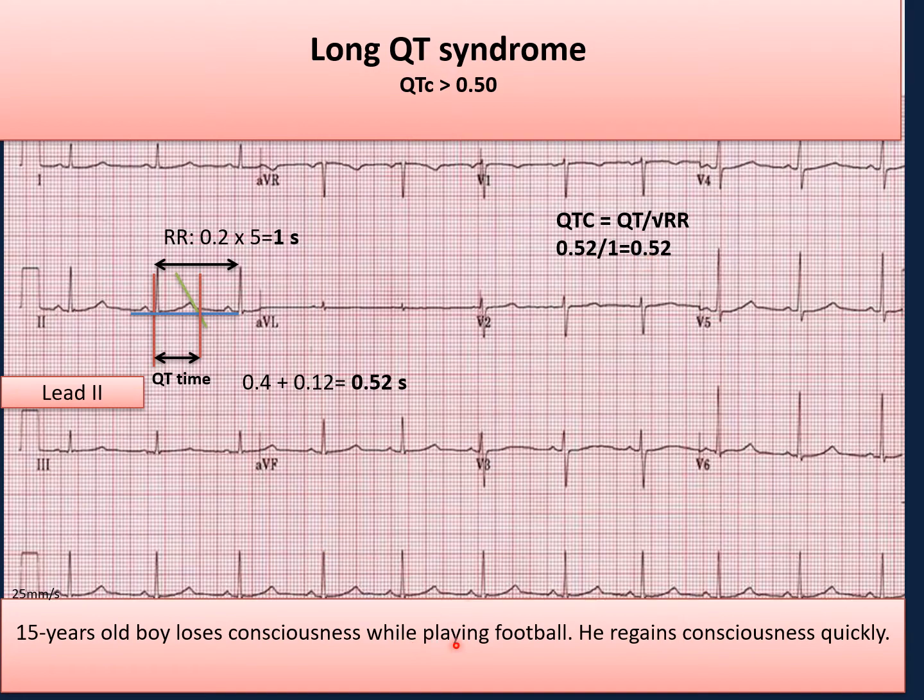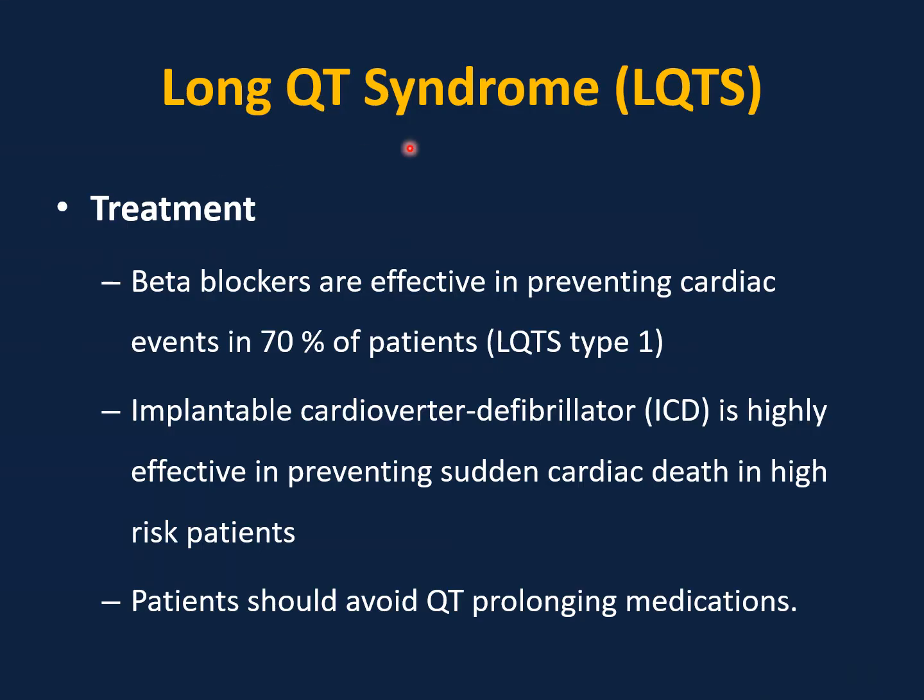That's why this adolescent is losing consciousness: because of the long QT syndrome. This can be precipitated by fear, startling, swimming, or exercise, because of the increase of adrenaline, and this will prolong the QT and can precipitate ventricular tachyarrhythmia and possible sudden death. Early detection, early referral, and treatment of cases of long QT syndrome is critical to prevent fatal ventricular tachyarrhythmia, syncope, and sudden death.